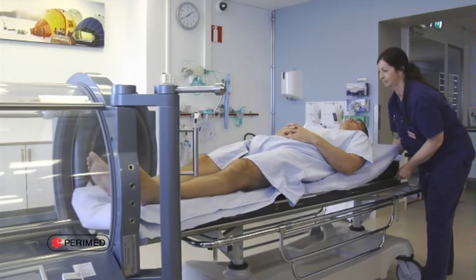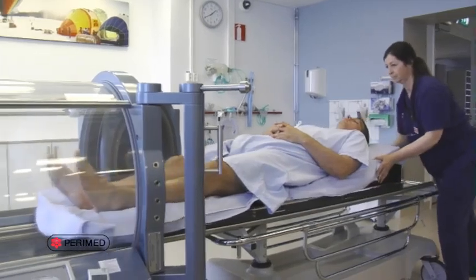Lastly, let's discuss predicting benefit from hyperbaric oxygen therapy. Transcutaneous values obtained while breathing normobaric air cannot be used to predict benefit from hyperbaric oxygen therapy. The sea-level oxygen challenge test is also not an accurate predictor of hyperbaric benefit. The best way to predict benefit from hyperbaric therapy is using in-chamber tcpO2.